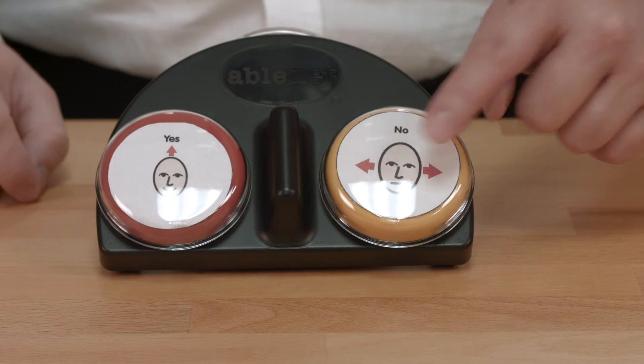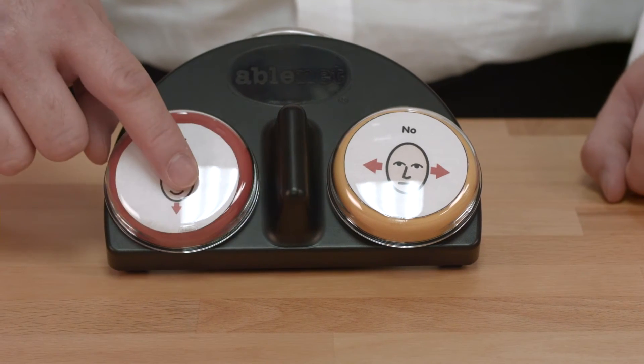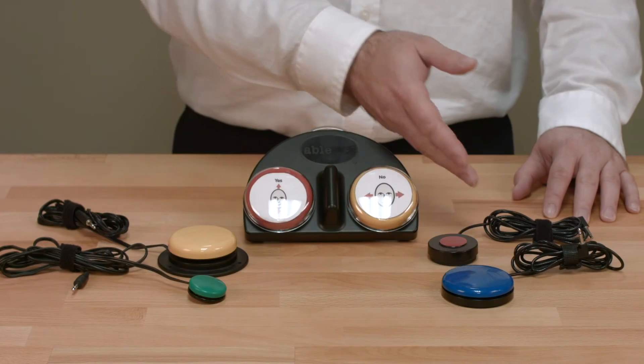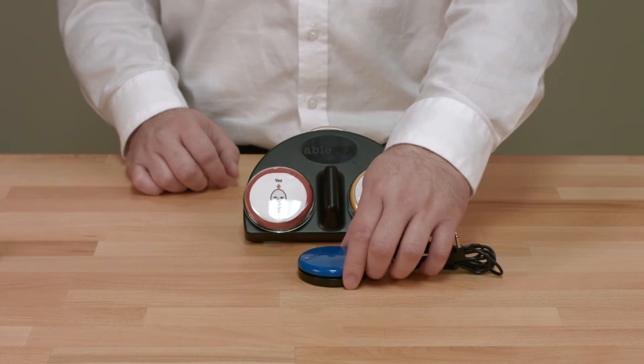Now that you have your two messages recorded, you can add a picture symbol to the switch top or attach a switch adapted toy or appliance to the device. If the user requires an external switch for an alternative method of access, one additional series of steps is required.